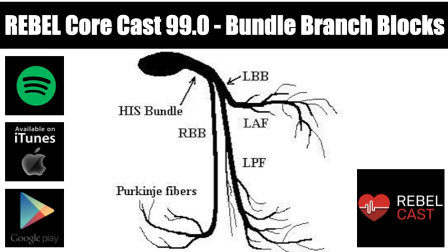In the left posterior fascicular block, or the left posterior hemiblock, you have blockage of that left posterior fascicle, and so all of the LV depolarization occurs through the left anterior fascicle. An isolated left posterior fascicular block is much less common than an isolated left anterior fascicular block. And when you look at the ECG with a left posterior fascicular block, what you're going to see is a right axis deviation, so QRS is up in 3 and AVF and down in 1. A slight prolongation of that QRS complex, but again, less than 120 milliseconds.